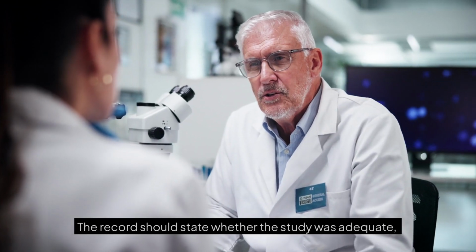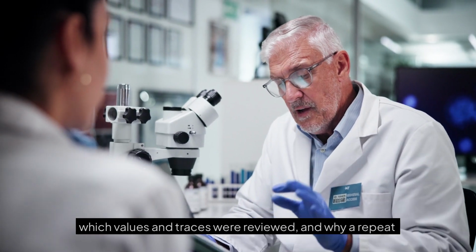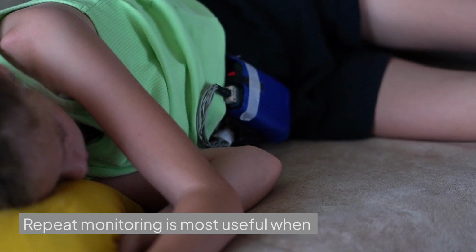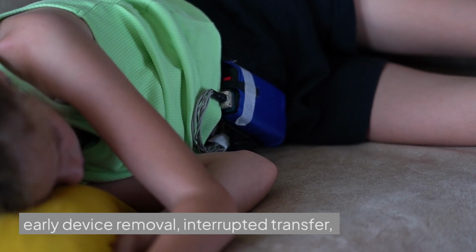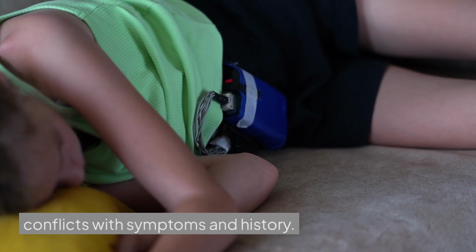The record should state whether the study was adequate, which values and traces were reviewed, and why a repeat capture, referral, or no immediate action was selected. Repeat monitoring is most useful when triggers are defined in advance, such as early device removal, interrupted transfer, prolonged low signal, or a result that conflicts with symptoms and history.